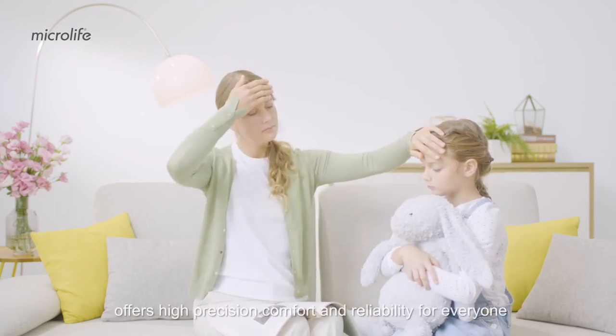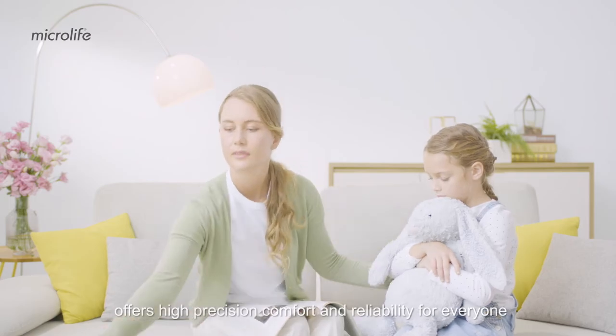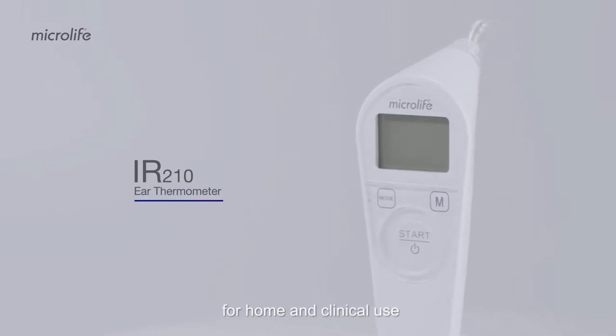MicroLIFE Thermometer offers high precision, comfort, and reliability for everyone. The IR-210 is a clinically tested ear thermometer for home and clinical use.